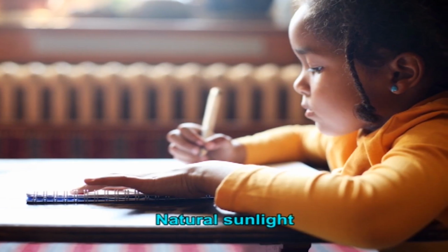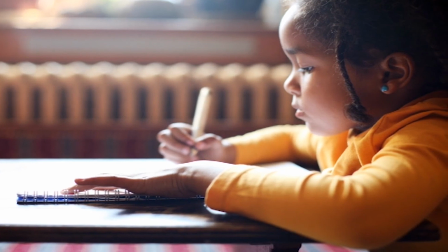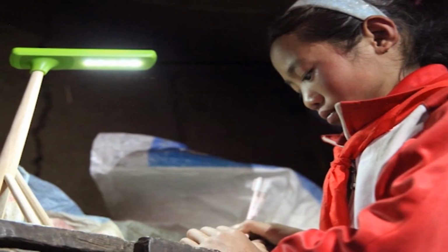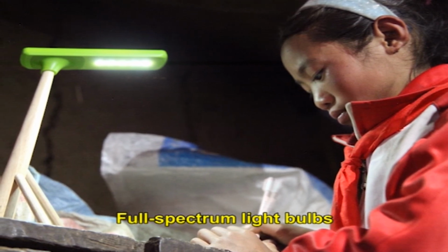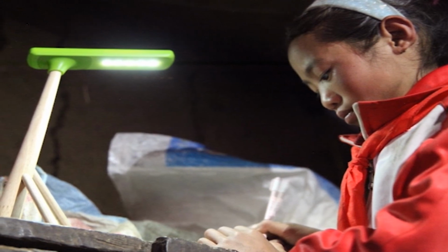Natural sunlight is the best lighting for reading. Arrange furniture so that the person with low vision can sit near a window for daytime reading. For artificial lighting, purchase full spectrum light bulbs. These bulbs emit light that more closely mimics natural sunlight than regular incandescent bulbs.